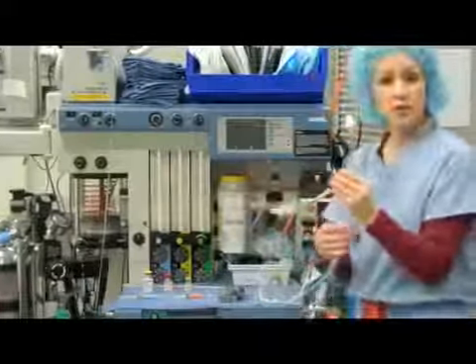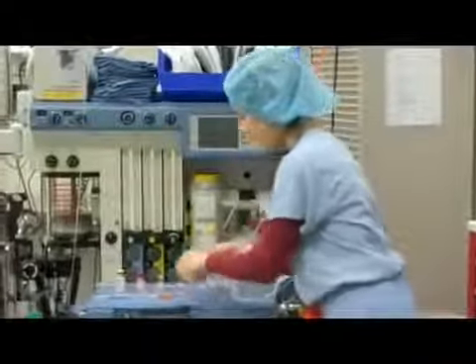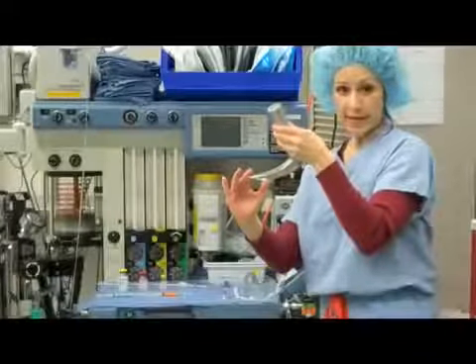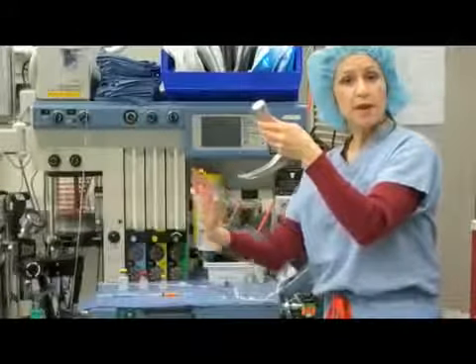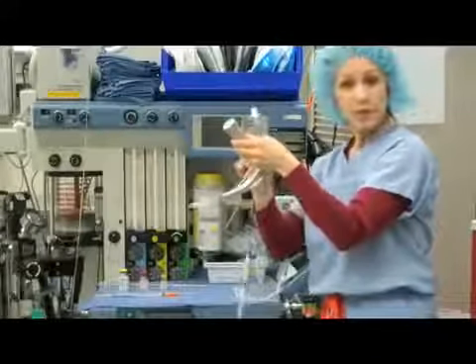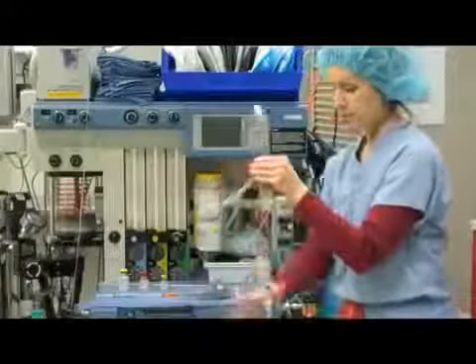This is called an endotracheal tube, or a breathing tube. It is placed in the mouth with the assistance of a laryngoscope. The laryngoscope has a light at the end of this blade. It is inserted into the mouth, and it lights up the back of the throat so we know where this breathing tube is going. Once the breathing tube has been inserted, we then gently remove the laryngoscope out of the mouth.